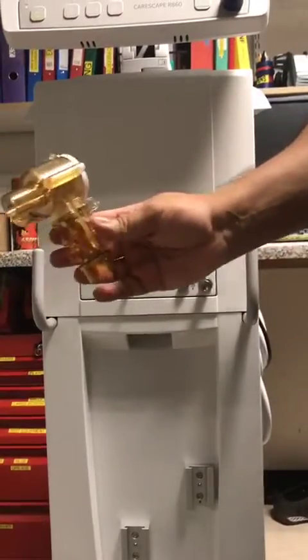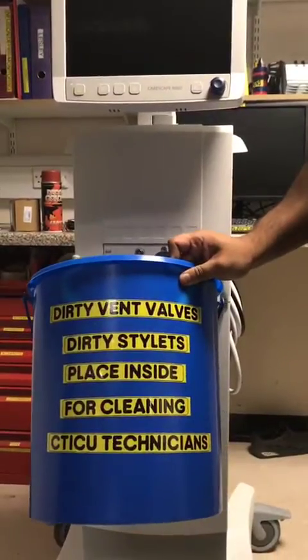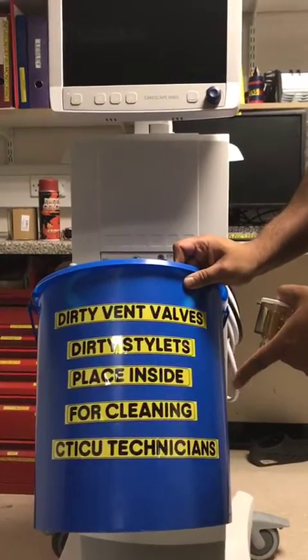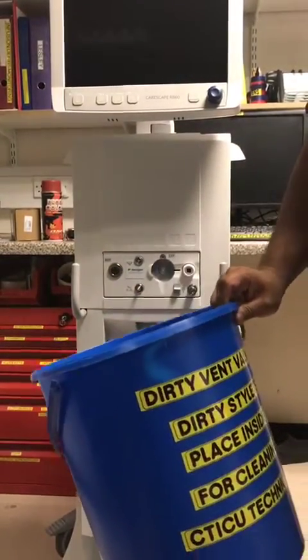You take the expiratory valve — wherever you'll be working, there'll be a blue bin indicating where you should put the autoclaving stuff. You put it in there and a technician will collect it.